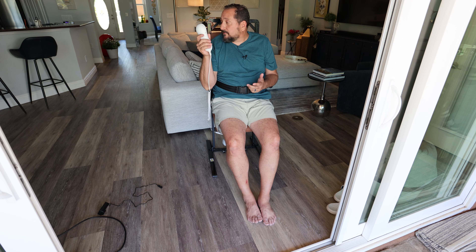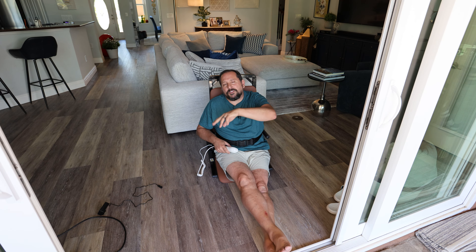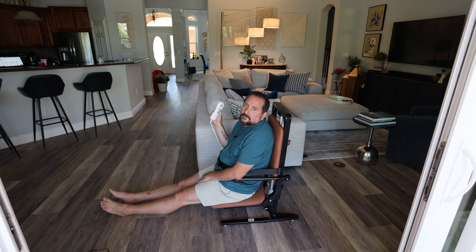It is so high — top floor, 22nd floor, everybody off! Let's bring it down so I can show you how to store this. There was one thing I forgot — if you're a caregiver, whether just a family member taking care of somebody or it's actually your occupation, this thing could really be a make-or-break item.